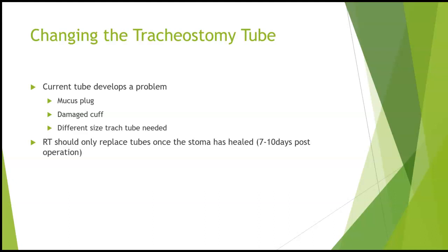We change tracheostomy tubes routinely, but we also might have to do this if we suspect that there's a mucus plug or the cuff is damaged, or we can do it therapeutically if we're looking at downsizing the trach, trying to get the tracheostomy out. So we might switch it to a smaller size purposefully.